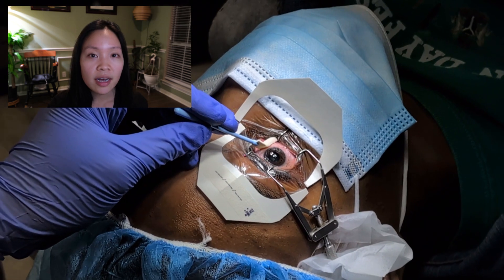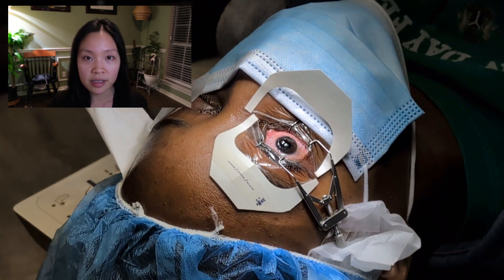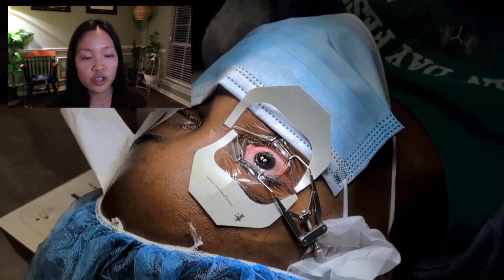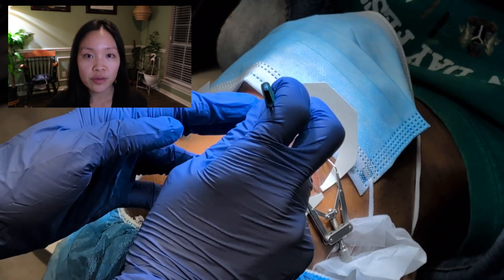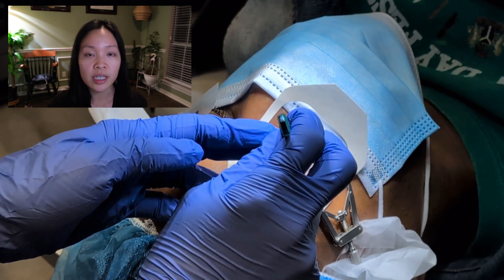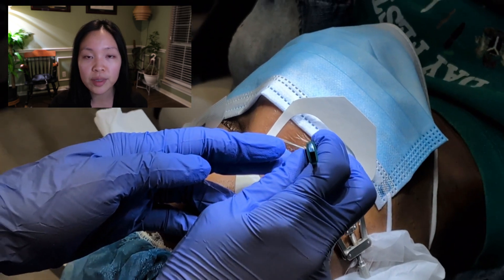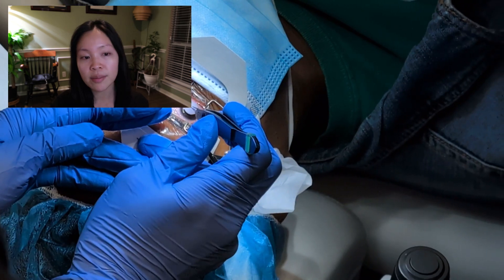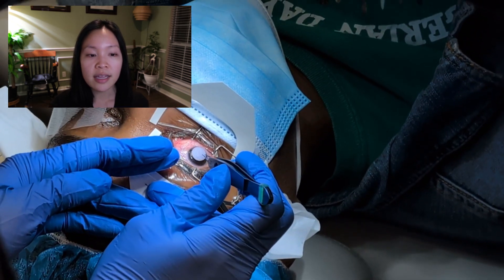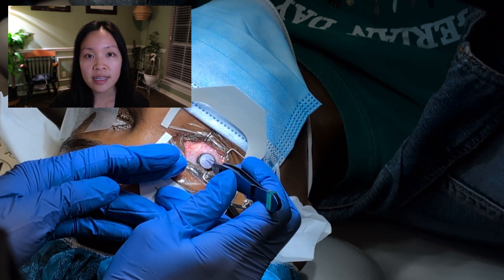About half a second before the treatment was done I paused the laser because she was moving her eyes around a little bit. The laser does have a tracking mechanism that will automatically help center the treatment even with small eye movements, but I am able to pause the treatment by taking my foot off the foot pedal and restart it as needed for any larger eye movements.